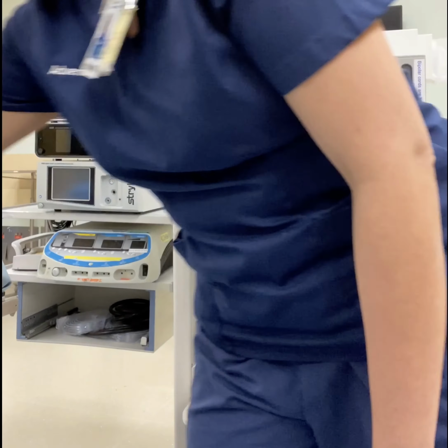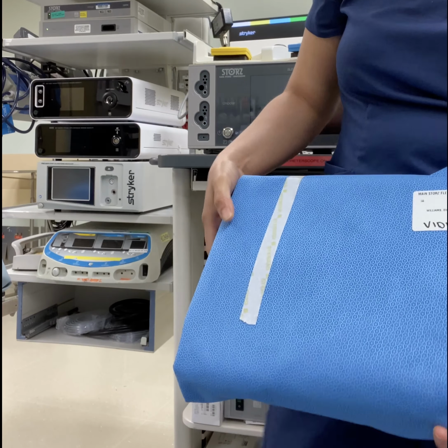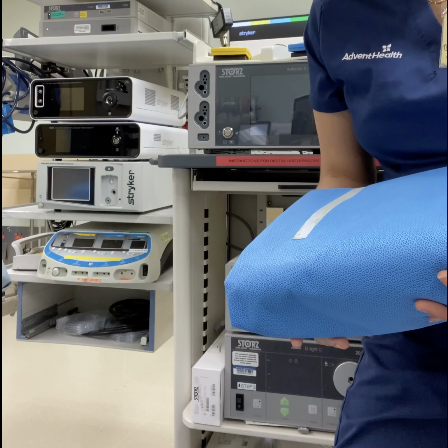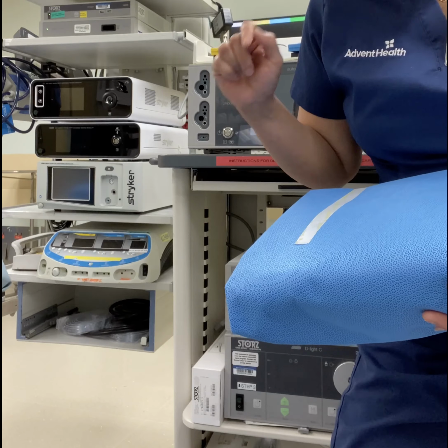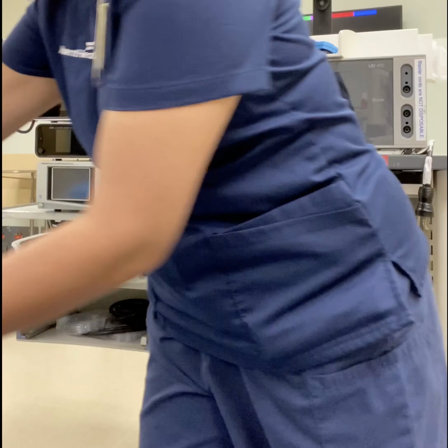The next thing will be your actual tray. It's going to say Storz Video Ureteroscope. It lives on the bottom shelf by OR3. It's between OR3 and OR1, on the urology cart, on the bottom of the shelf.